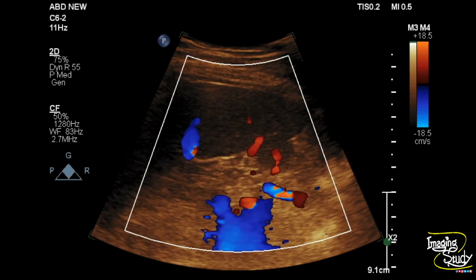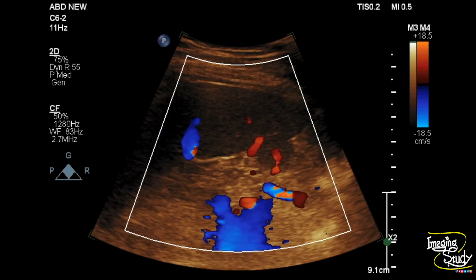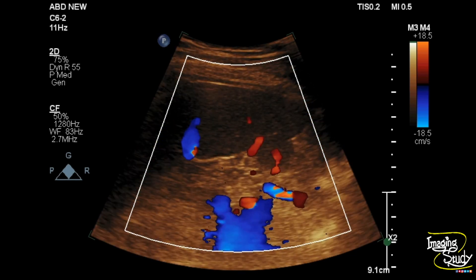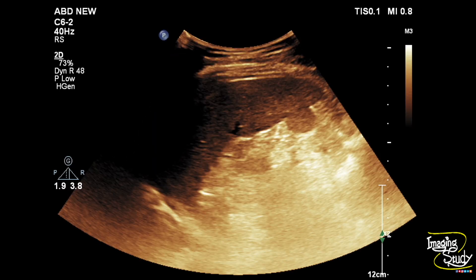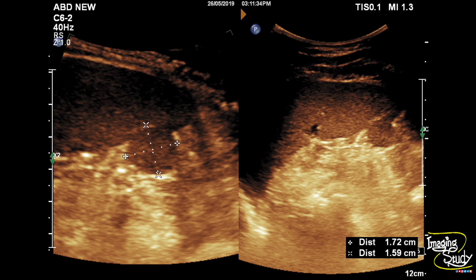There is no other abnormality seen. Here's the picture of this capsulated round structure at the lower part of the splenic hilum, and here's the magnified image — you can see the capsule here. The structure measures about 17 x 16 mm.